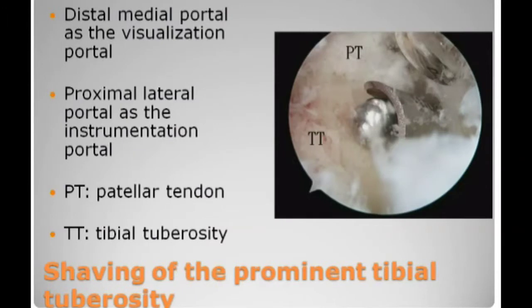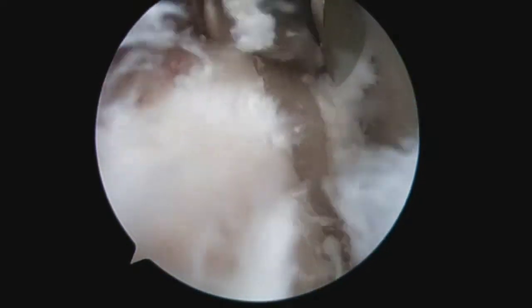The next step is shaving of the prominent tibial tuberosity. It is important to identify the tibial tuberosity and the patellar tendon insertion, and the bone shaving should not violate the tendon insertion.